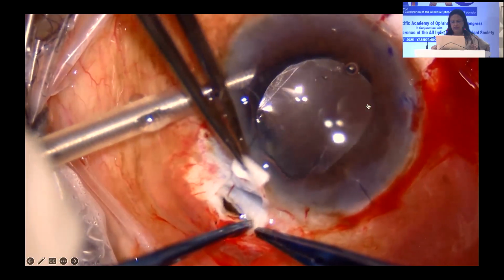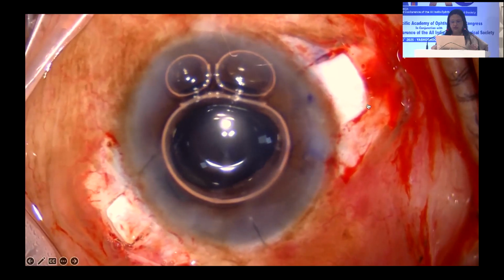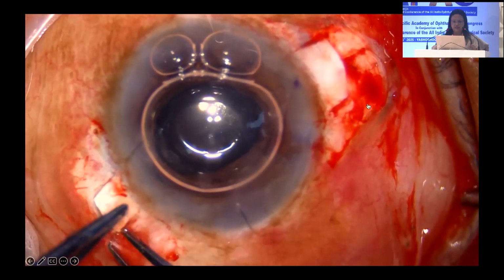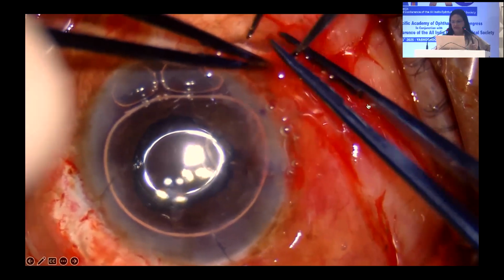A little bit of iris prolapse, actually, you really don't have to worry about. You can always tuck it back in, and you're going to glue the flap anyway. And the glue is applied, and the procedure is completed, and the patient again has a follow-up of about 7-8 years.